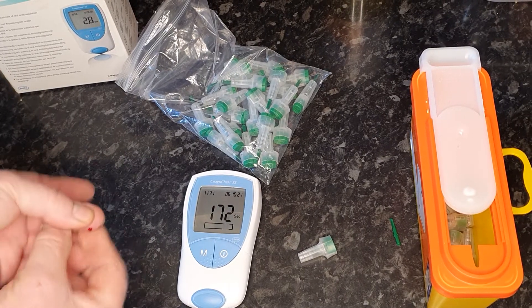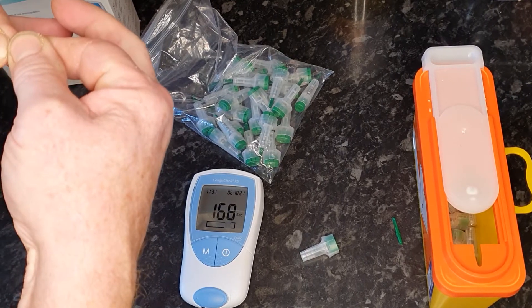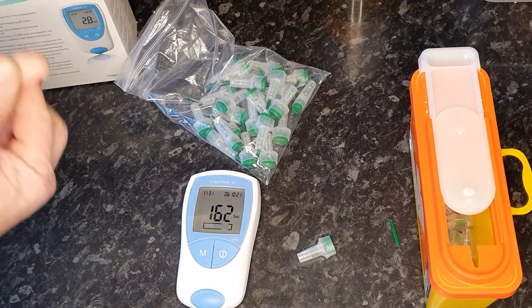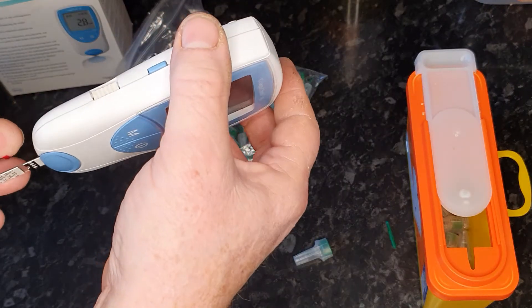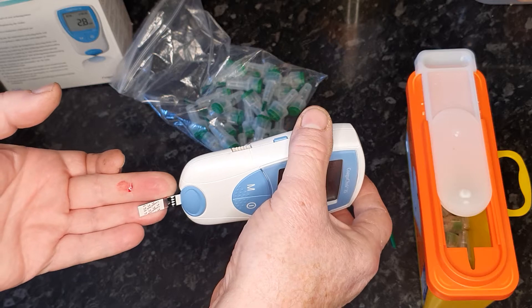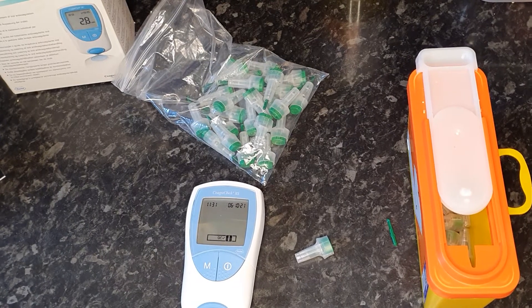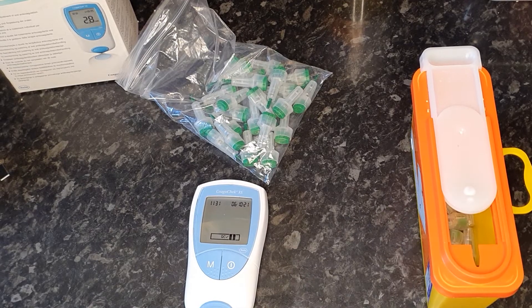You want a good blob of blood, and it wants to be the first blob of blood that comes out of your finger. Get a good sized blob of blood and apply it to the machine on the strip. It'll beep to confirm it's read and it'll display QC — a little tick. You can then put the used bits inside the sharps container.